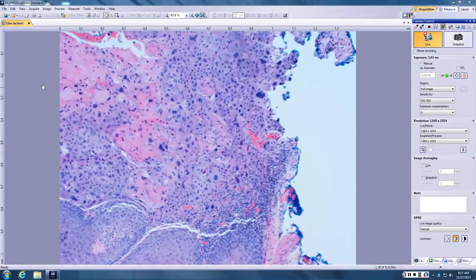Actually, if it's making any keratin at all, it still falls into moderately. So well differentiated are glassy red, like a KA. Poorly differentiated is spindled or anaplastic, making no keratin. The only way you know it's a squame is immunostaining. And everything in between is moderate.